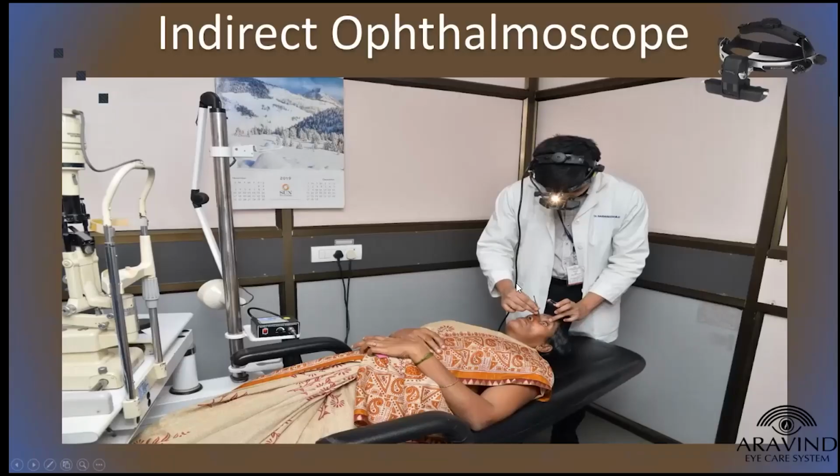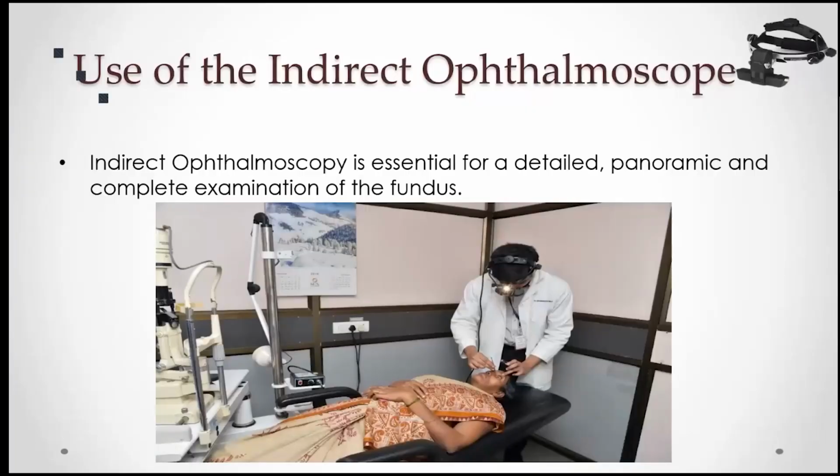So let us move on to the indirect ophthalmoscope. The indirect ophthalmoscope is another beautiful equipment to examine the fundus of the eye, and it is a binocular equipment. It is essential for examining the fundus with a detailed, panoramic and complete view. Not only is it an examining diagnostic device, it can also be used as a treating device by attaching a laser delivery device to it. We can use it as a laser indirect ophthalmoscope too.